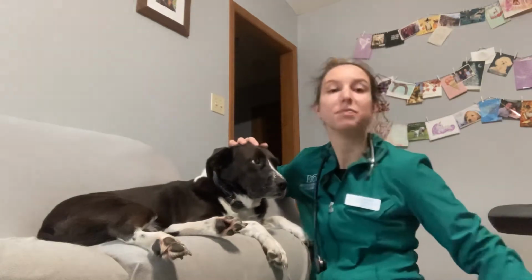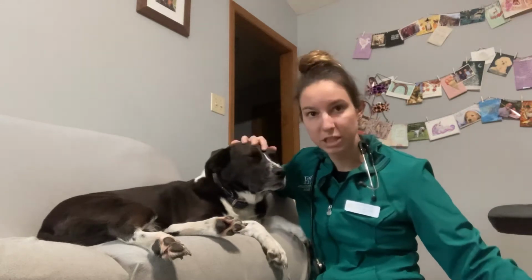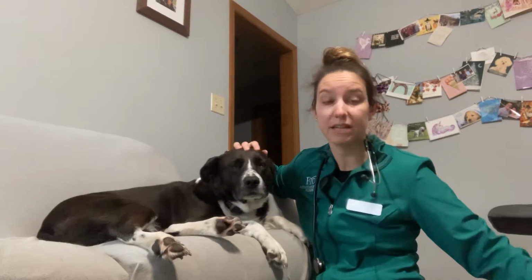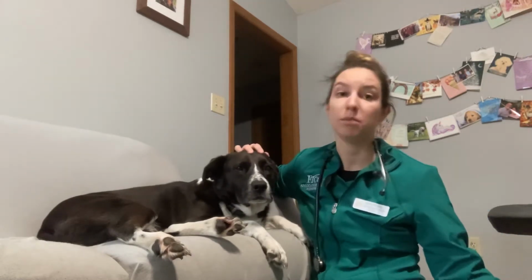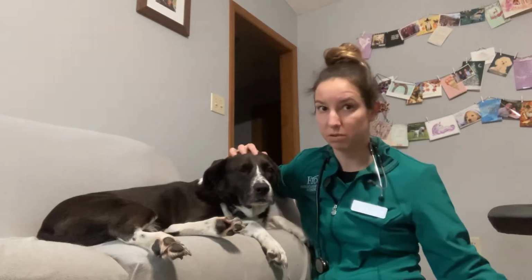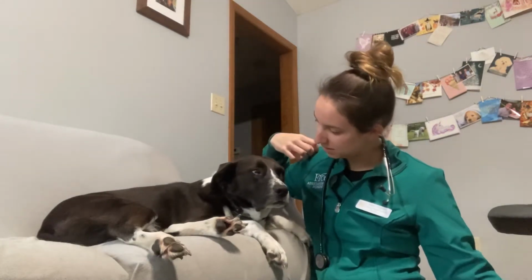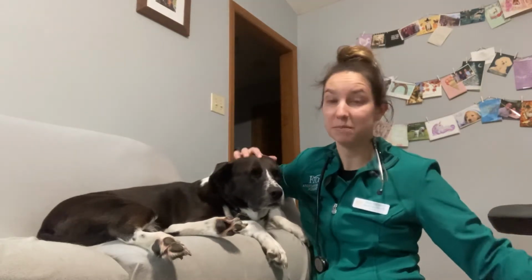Good girl, thank you. I think pain is a great way to build some rapport, get to know your patient, and also know ahead of time if you need to take any considerations while taking vitals. For example, if their left arm is the arm that has pain, maybe we use our right arm for blood pressure and pulse instead. So Sadie, are you in any pain today? No, I think Sadie just wants more belly rubs.